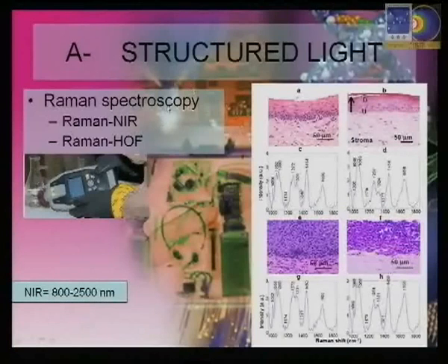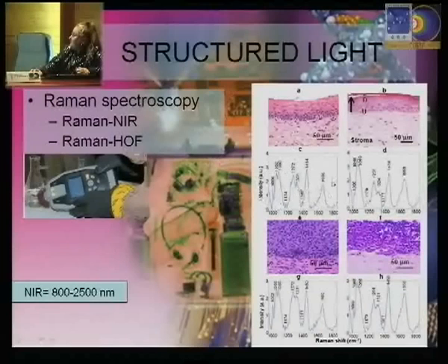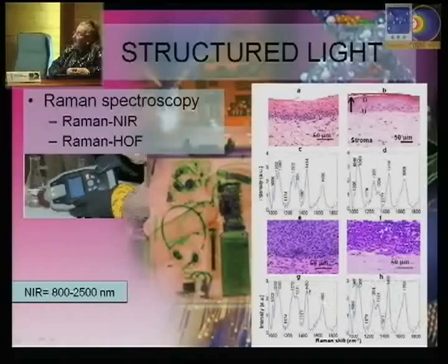The problem of the Raman spectroscopy is the low signal, and you have to have very high-quality fibers in order to get better information. The thing is that you get a series of curves which are different from the normal epithelium to the malignant epithelium, and if we are able to classify it and these differences are persistent in the trial, then you can automatically classify what are the malignancy or the benignancy areas.